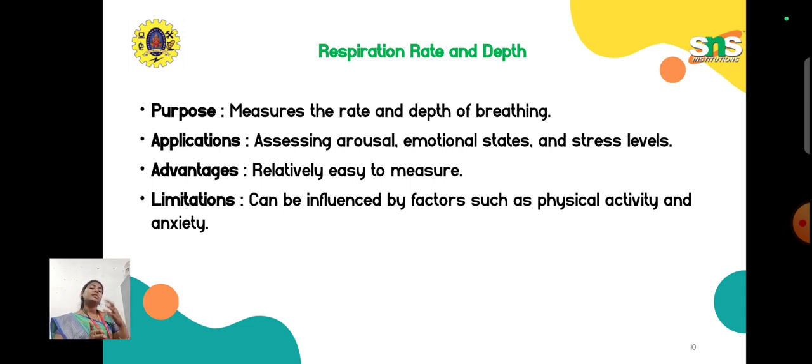In that case, the respiration changes are because of the physical activity and are nowhere related to the emotional status of that particular person. So we have to make the person be calm for a certain duration before going into a test. These things have to be taken into consideration when we go for respiration rate or depth techniques.